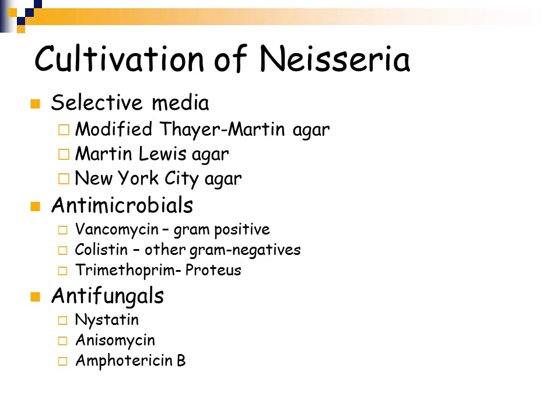It's an incredibly important media, and I would say most clinical laboratories use Thayer-Martin to streak out all genital samples in order to rule out Neisseria gonorrhea.